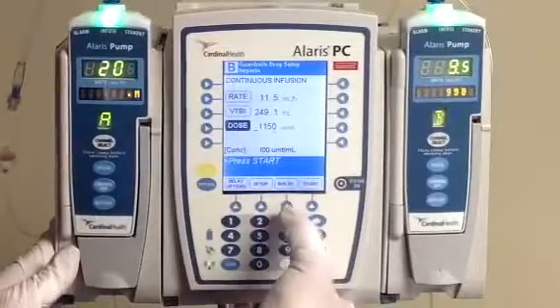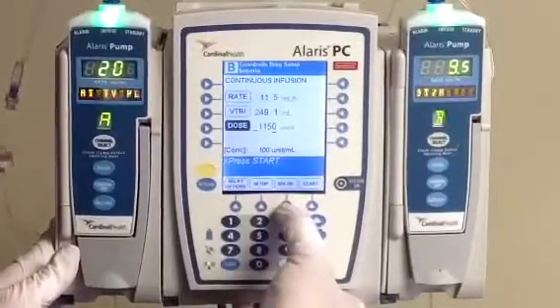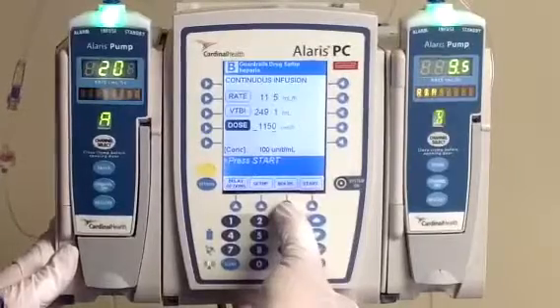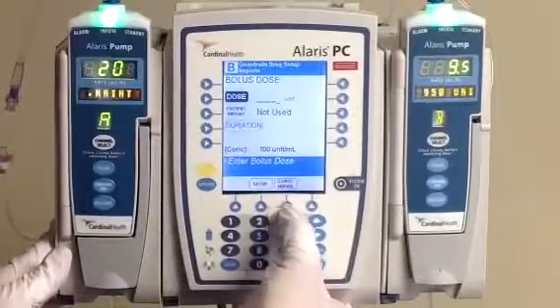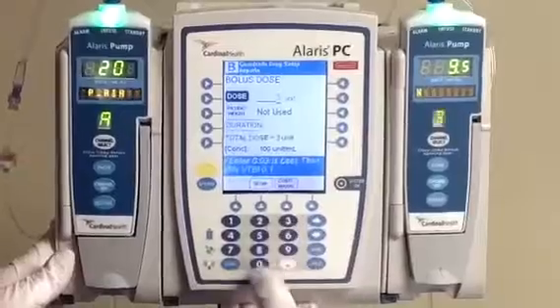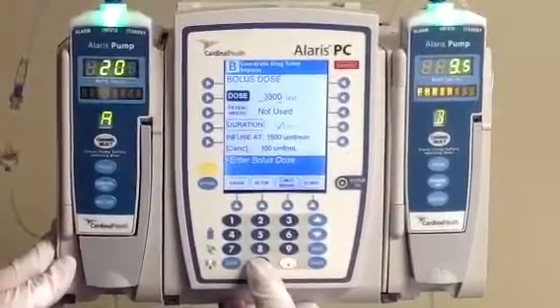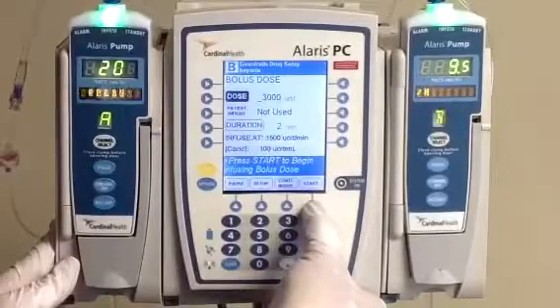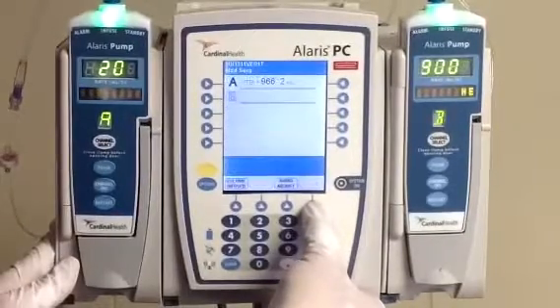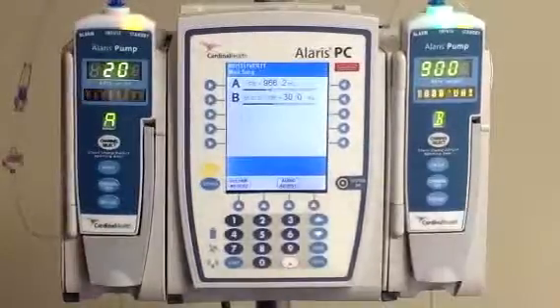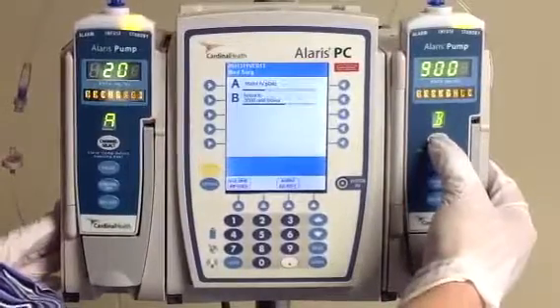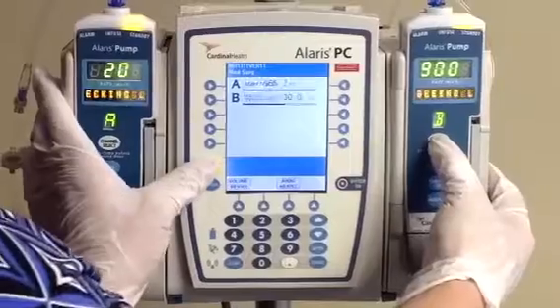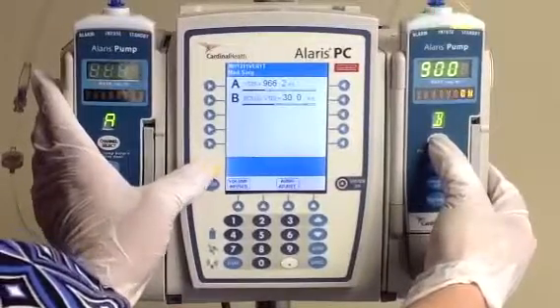Our next step is to actually give the bolus, and we bolus from the bag so we don't have to open up our closed system. Click on the bolus button at the bottom of the screen and type in your bolus of 3,000 units. It's going to automatically calculate a duration for you. Go ahead and hit start to begin your bolus. Once it's done bolusing the 3,000 units, it is going to change right back over to our rate of 11.5.